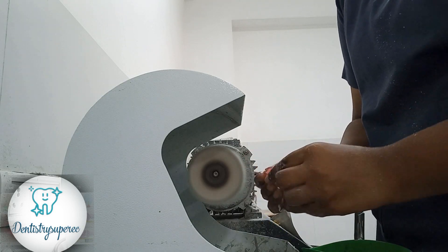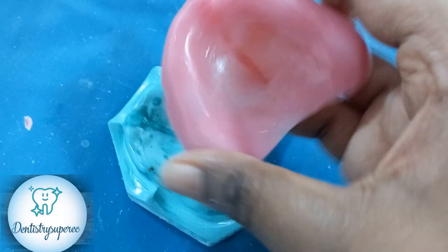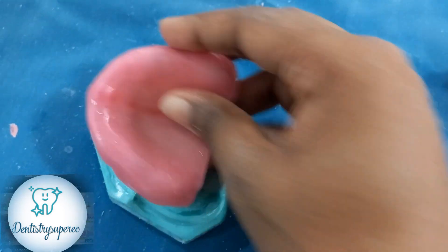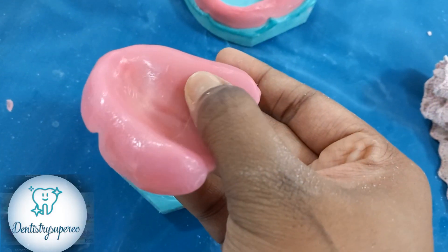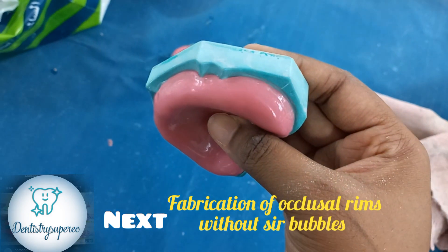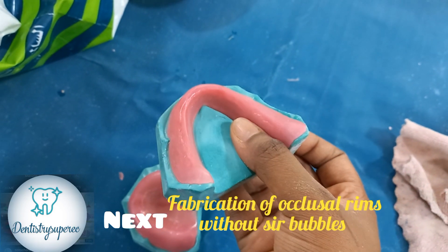We have almost finished with our maxillary and mandibular denture pumice. The dentures are well polished — not perfectly well polished because we have not used all the acrylic burs and all the sandpaper grit sizes. But if you use all the sizes available, it may take five minutes or less, and the end result will be amazing. This is the final look we have got. Hope you all gained something from this, and next will be my fabrication video.